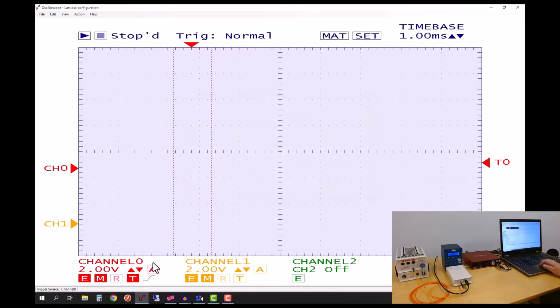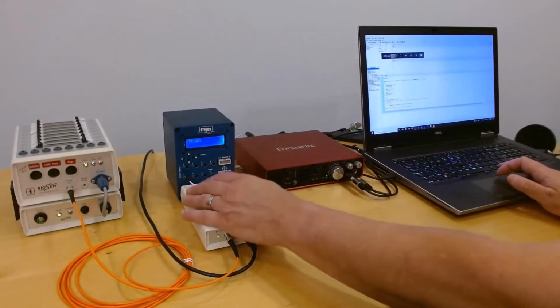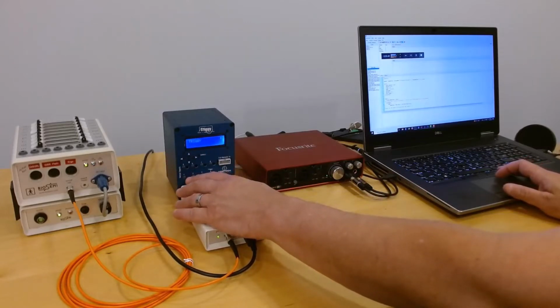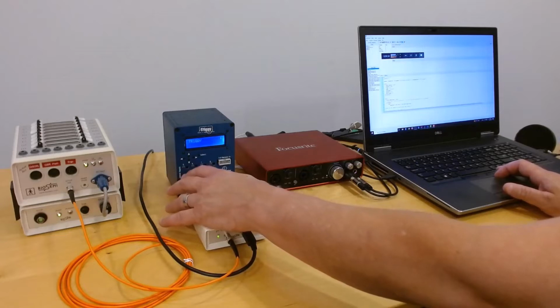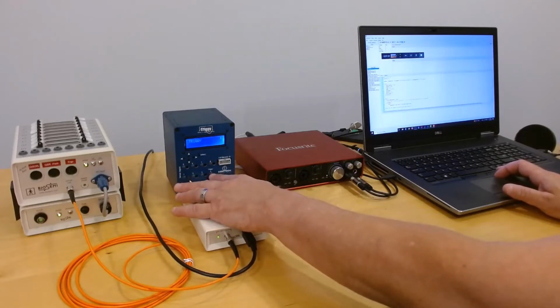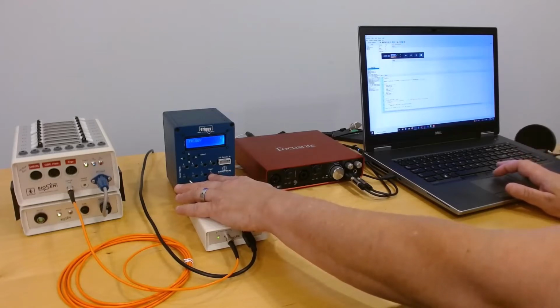But so DAC number 0 and 2, those are even, so they're representing digital channels from Triggy. So the way I have them assigned to Triggy is that the DAC 0, displayed on the oscilloscope as channel 0, is coming from the first Triggy channel, and the digital representation of the trigger, which is coming from the serial port, is represented on channel 1 of the oscilloscope software.